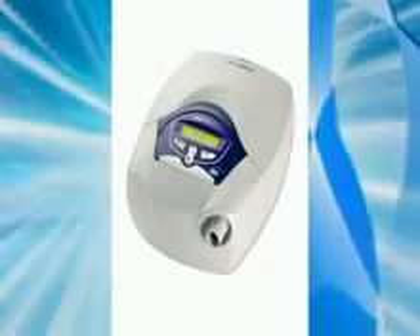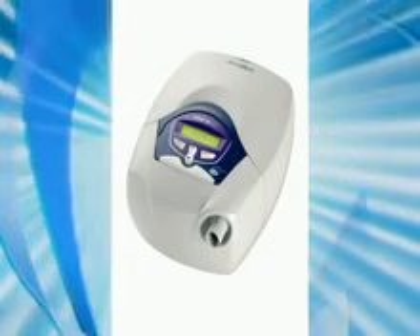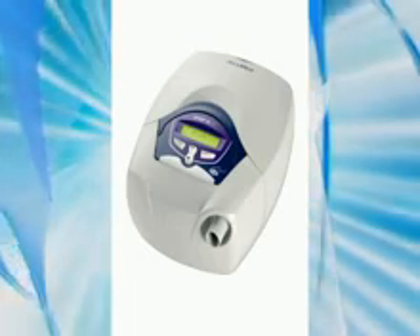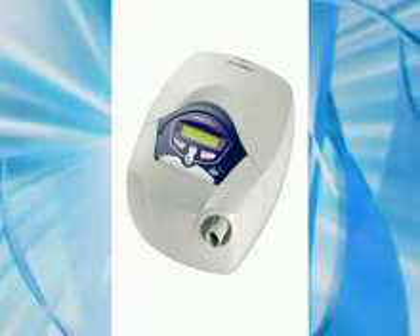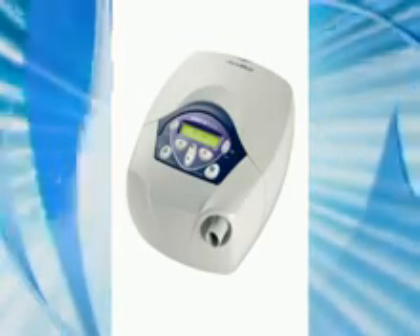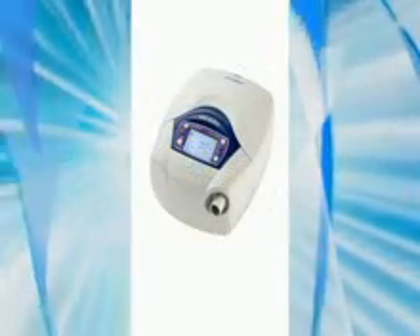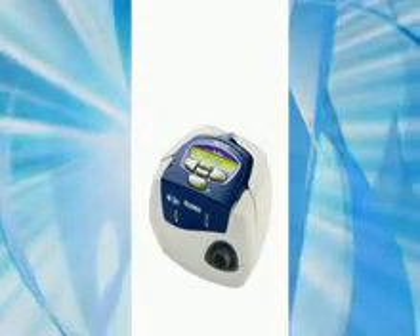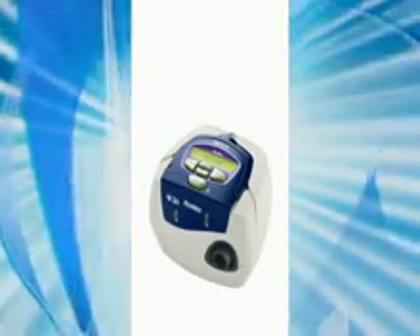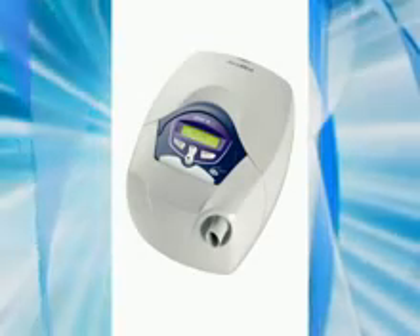You've been started on one of these positive pressure ventilators to support your breathing during sleep and/or during the day as prescribed by your doctor. These include the ResMed VPAP 3 ST, ResMed VPAP 3 STA, ResMed VPAP 3 STA QuickNav, ResMed VPAP 4 ST, or similar machine. During the course of this video, we'll be using the VPAP 3 ST.